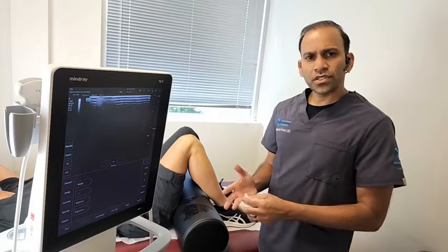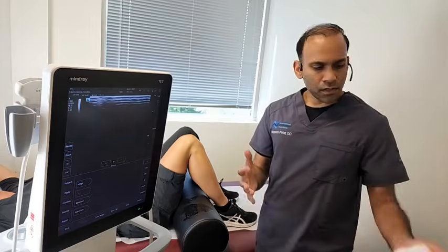Hope you were able to actually see everything. If you weren't, I'll look at the video and we'll retape it again.